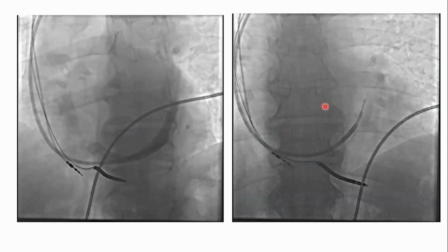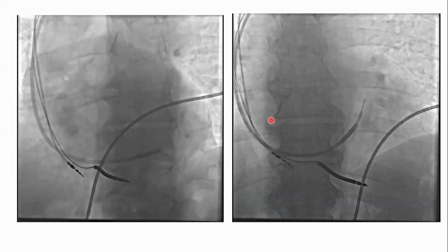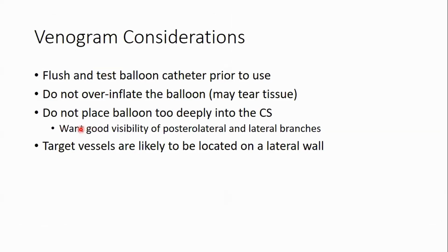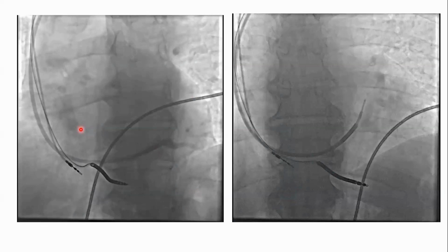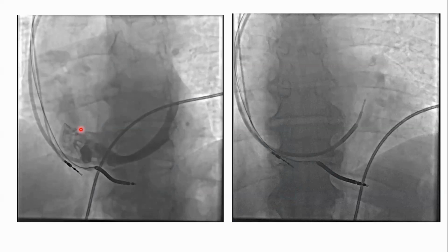And you can see that I'm playing right now a video of an angiogram which was done without balloon. Having some challenges playing the videos. So I'm just going to go back and then come. Yeah, so this is a venogram done without a balloon.